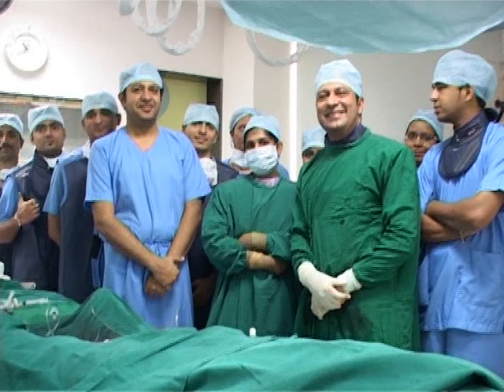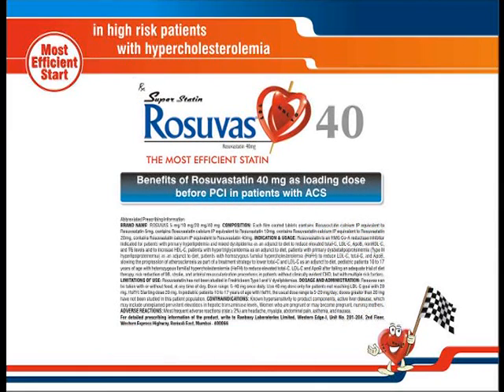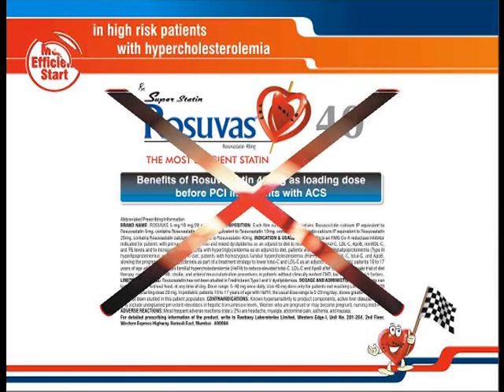This patient, being a diabetic, if you look through the IVUS image, had diffuse minor fatty plaques throughout the length of the coronary artery, both the distal, the mid and the proximal segment of the LAD. Where I stented was the fibrotic lesion in the proximal segment of the LAD as seen on the IVUS, but the minor fatty plaques throughout the length of the coronary should respond very well in terms of regression of the plaque on a high dose 40 mg rosuvastatin, which should be given at least for 6 weeks post stent deployment.